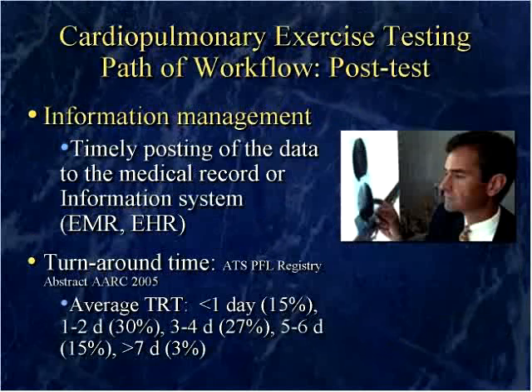And that's where this whole process of looking across the path of workflow, every segment of your testing schematic, comes in, as far as whether or not you're providing a good product. Because if you can't get a test out in a timely fashion, then that's not a good product to your clinicians.